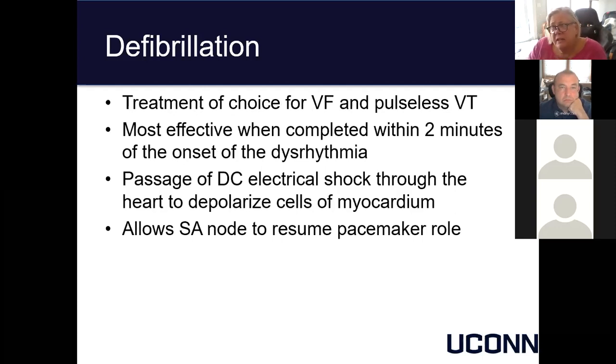Well, actually, Kristen, what it means is there is a discernible rhythm. There is electrical activity to sync up to. If you defibrillate on the T wave, because of whatever polarized phase it's in, you can risk taking a bad rhythm that you're shocking to a worse rhythm.